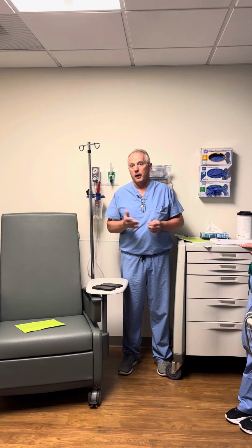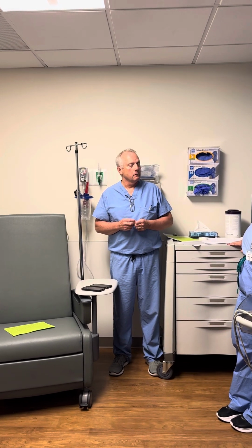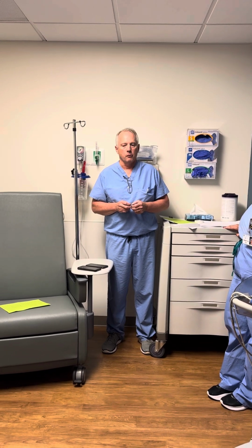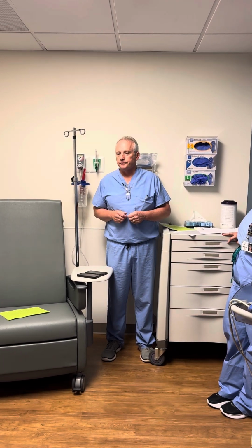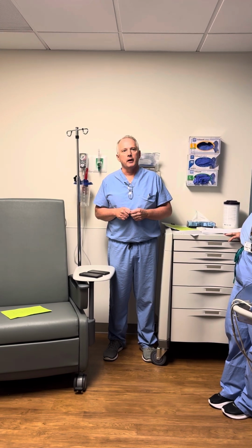You know, MRIs, but not for something like this. The EMI and MRI is huge, so you have to do something. You have to do programming for that. But it's basically putting them in the same mode as what a magnet does. Yeah, that's it, really. There isn't a whole lot else to it.